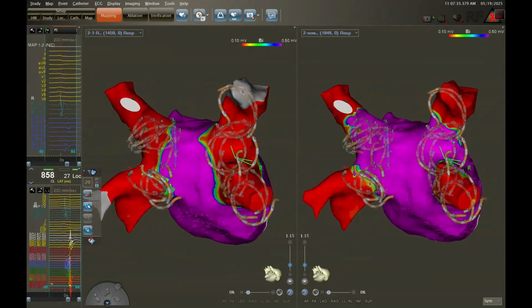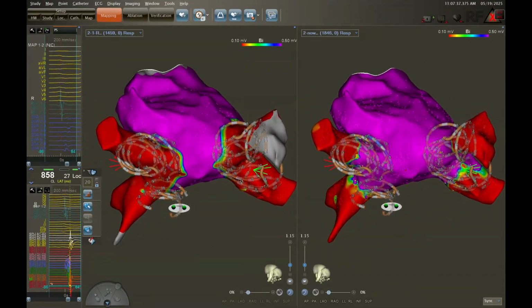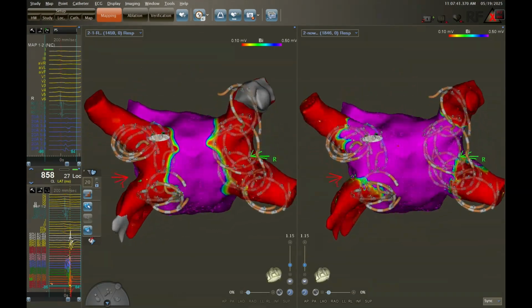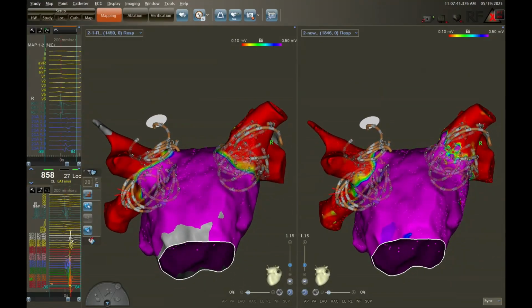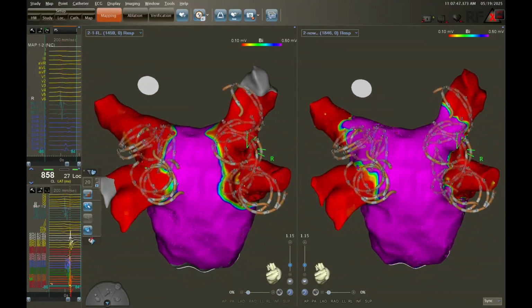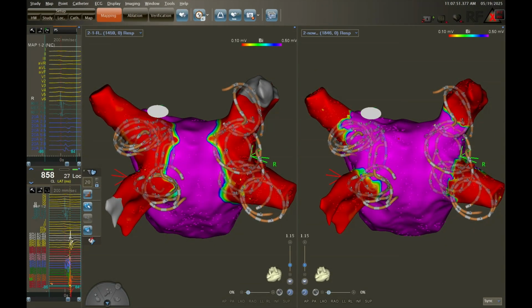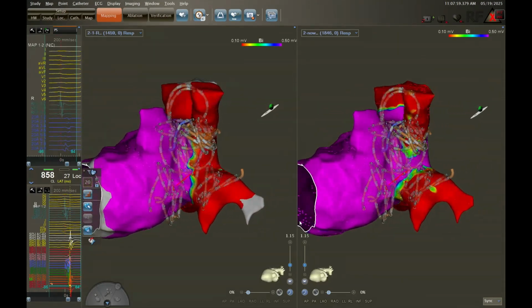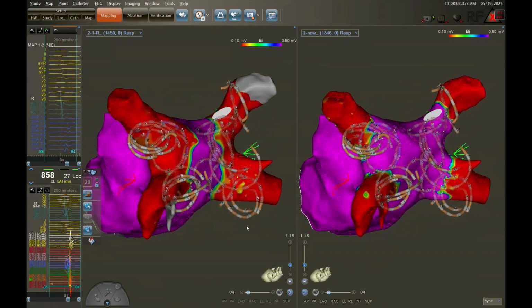And Peter, just one thing. I just got a summary of this case. PVI duration was 16 minutes, and flow time 10 minutes, and we did 48 applications for 4 veins. Okay, 48 applications is something we are not even considering some hemolysis effect or whatever. And I think it's very nice to show how fast the learning curve is for this. As I mentioned, this is our 3rd case here, and this learning curve is very, very fast.